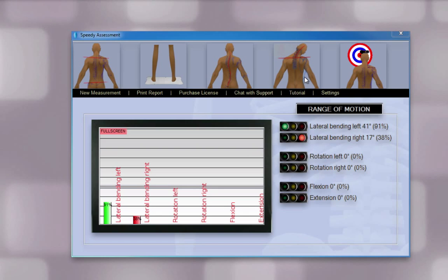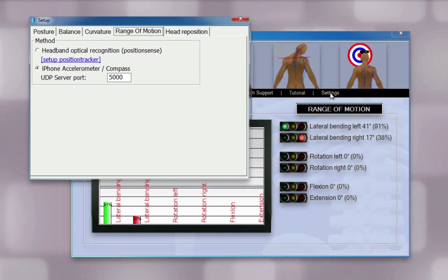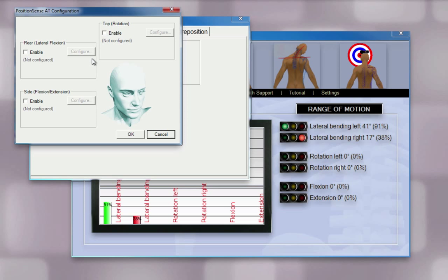That was using the iPhone. Now let's see how it works with a webcam. Click on Settings, then select the tab for Range of Motion. Choose Headband Optical Recognition. Click Setup Position Tracker. Choose which movements you would like to assess — here, we're selecting only lateral flexion.